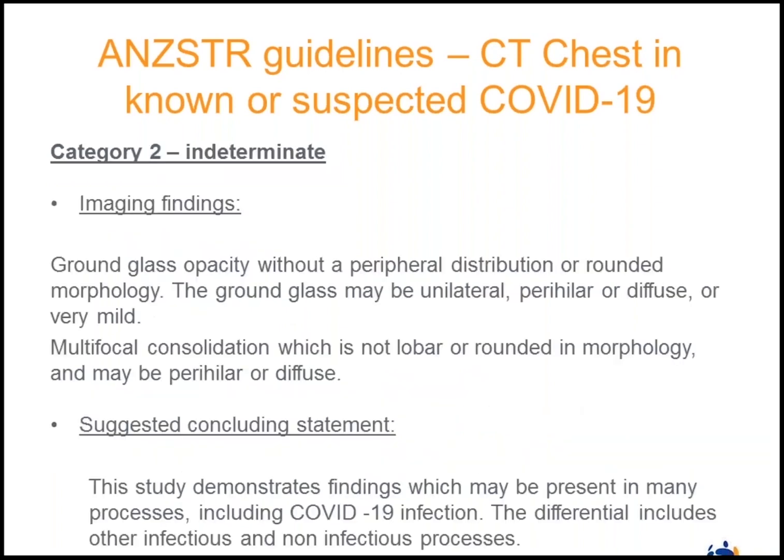I won't show an example of a normal case. I'm assuming we're all familiar with that already. But category 2, so the indeterminate category.